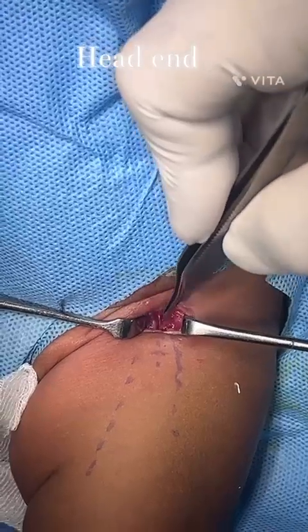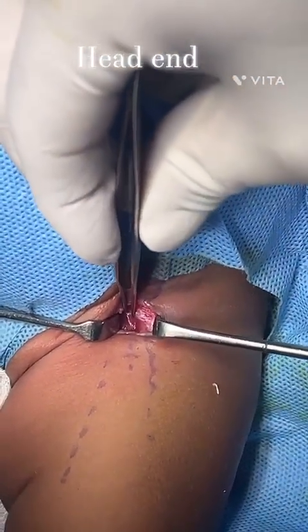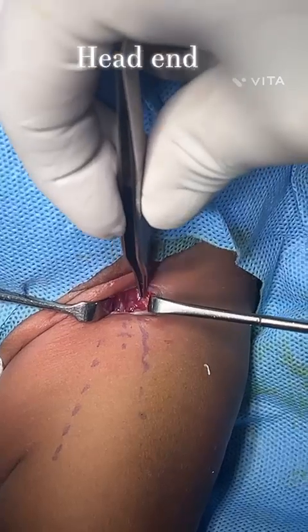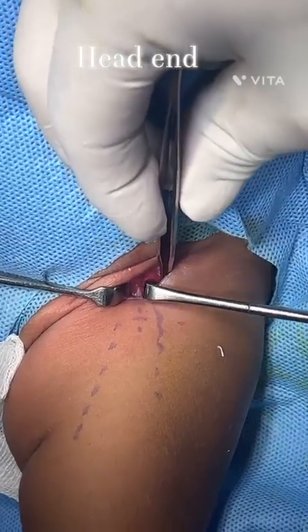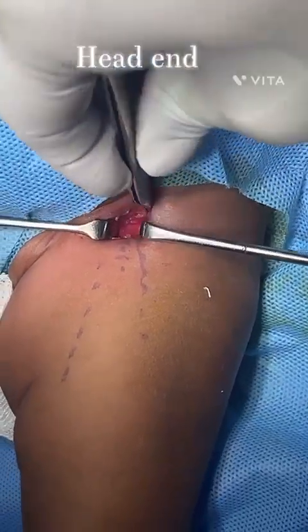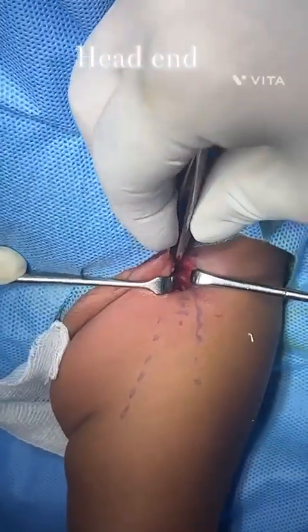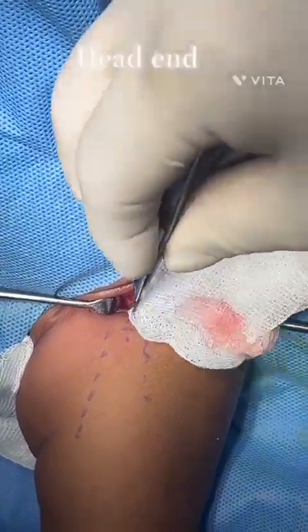Once we retract the sartorius and tensor fascia lata, below that lies the rectus femoris muscle attached to AIS. You can either go lateral to rectus or medial to rectus. Here we are going medial to rectus. And once we retract the rectus, we see a shiny layer below that, and that is the hip capsule.